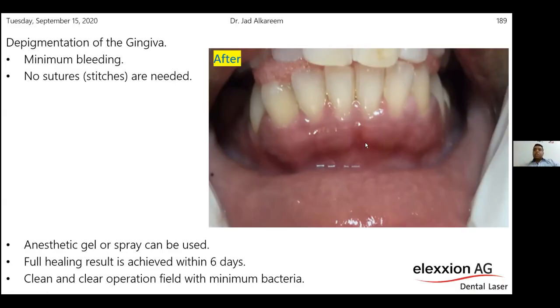To do the initiation, you have to use a very dark surface. I can recommend eye mascara, because it has a very, very dark surface to do the initiation very fast. I don't recommend using the articulating papers that you have in your clinic because they are not dark enough to do the initiation process. Plus, sometimes they burn, so they can make some smoke. So eye mascara is the best way to do the initiation.